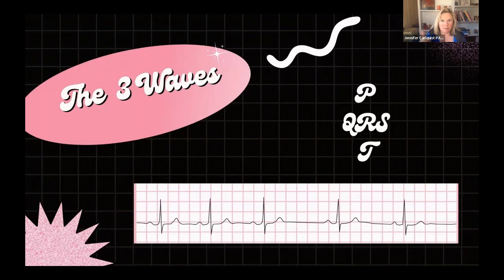And what is the cause of sinus arrhythmias? This is a really good thing to know because sometimes people think this is Afib, but it's not Afib, and we can get lulled into thinking that. But this happens in young, healthy people. Medication and caffeine, but also breathing. Breathing can cause this. So at the end of the day, this was a sinus arrhythmia.